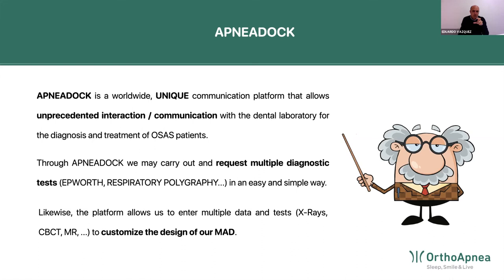But if changes are extensive, in these cases, you will obviously need to change either the upper splint or the lower splint. But probably by that time you already know the correct degree of protrusion, so you will only need to change one of the two splints. Or obviously, if you have made prosthetic treatments, or any other dental treatments in both dental arches, then you need to change both splints in that case, yes. But for minor changes, no, you can adapt that. You can make those adaptations.